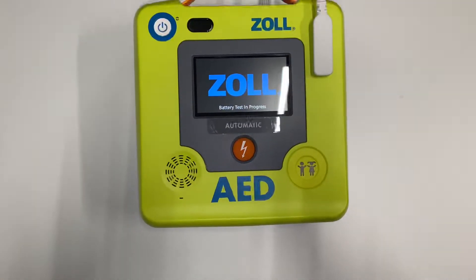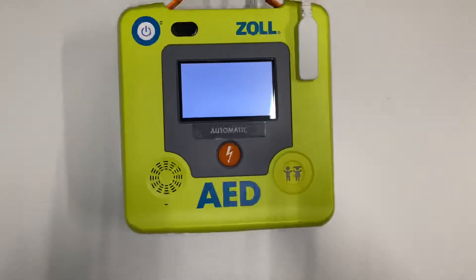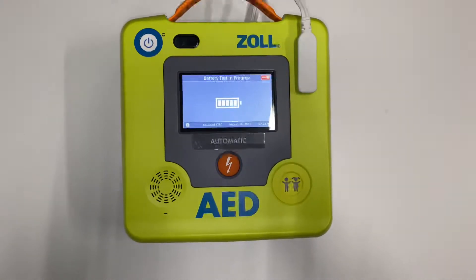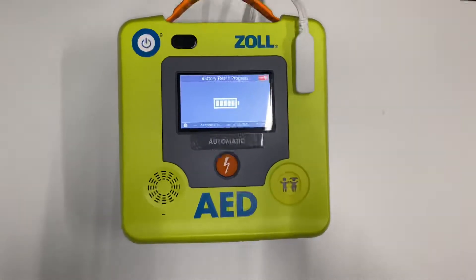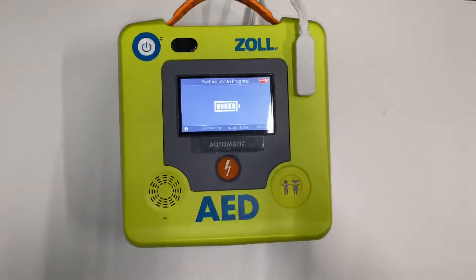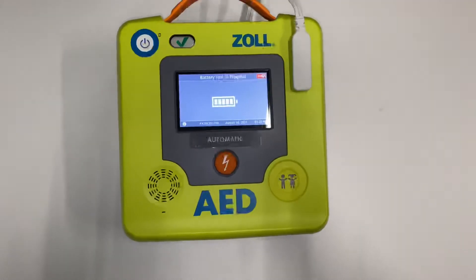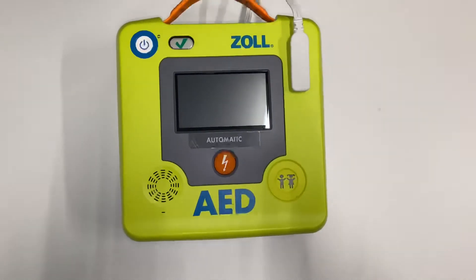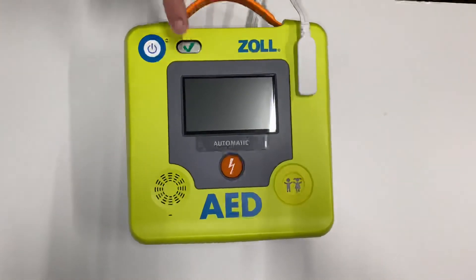The defibrillator will now perform a self-test — just wait a moment. You can see the battery is fully charged. Sometimes it may be slightly lower than full because they test the battery before sending it to you. You'll hear the device say 'unit okay,' and the green tick will appear in the front-facing window.